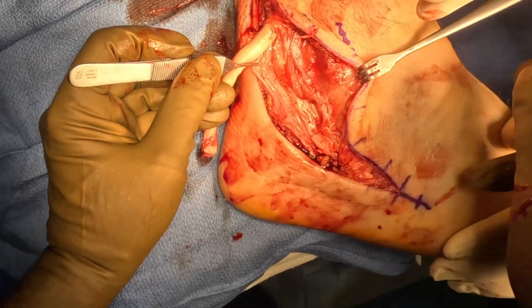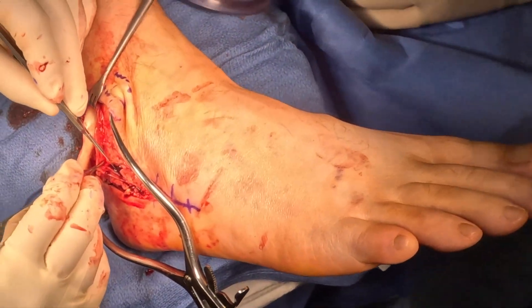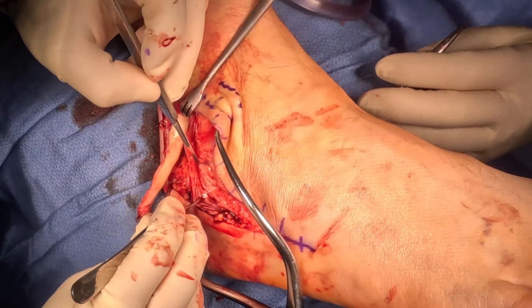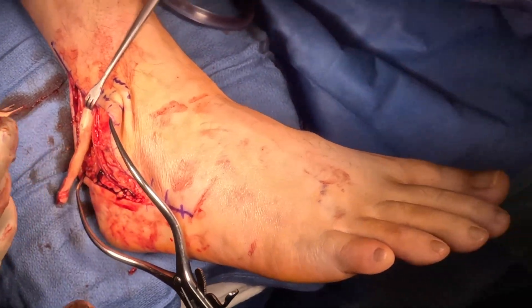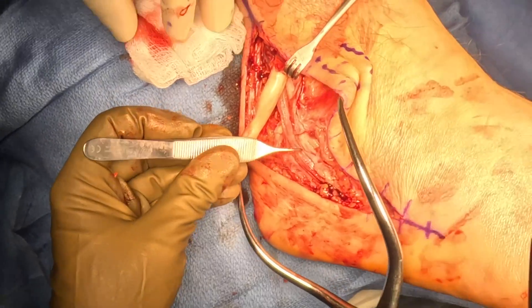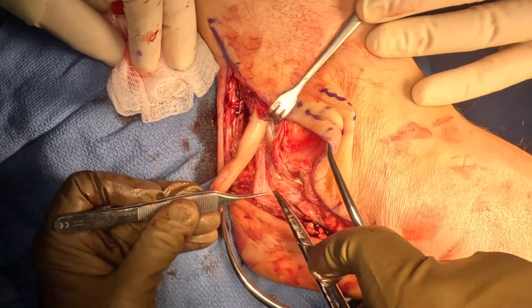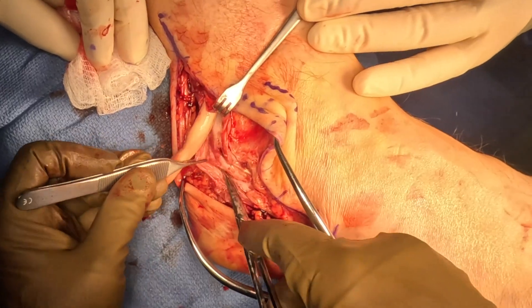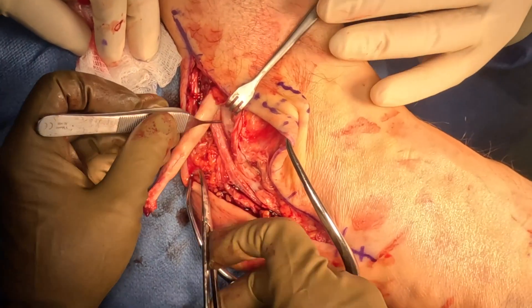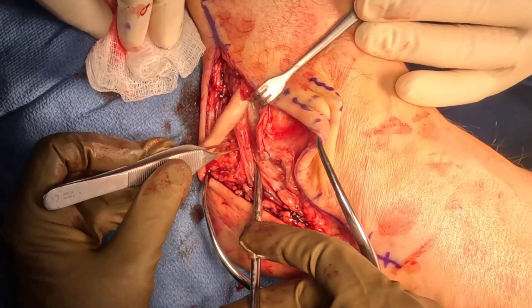So how do we repair something like this? We're going to do two things. We're going to tubularize the longus tendon, because if you were to hold and palpate that tendon, there are two large portions of what we would refer to as mucoid degeneration within the tendon — two large bulbous structures. We're going to internally cut them out and tubularize that tendon.